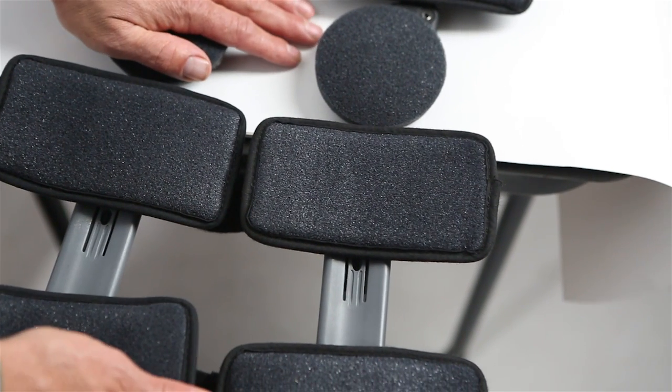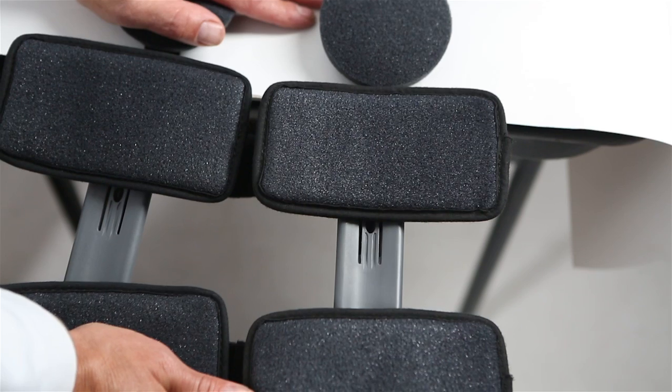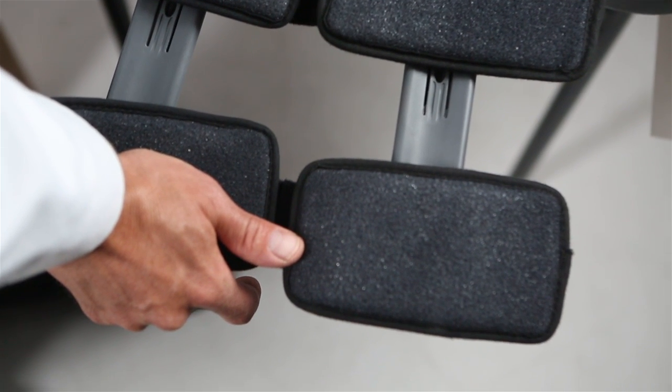The adjustability of the Exact ROM makes it suitable for a wide range of patients recovering from knee surgery, and it provides those patients with a controlled and precise range of motion.